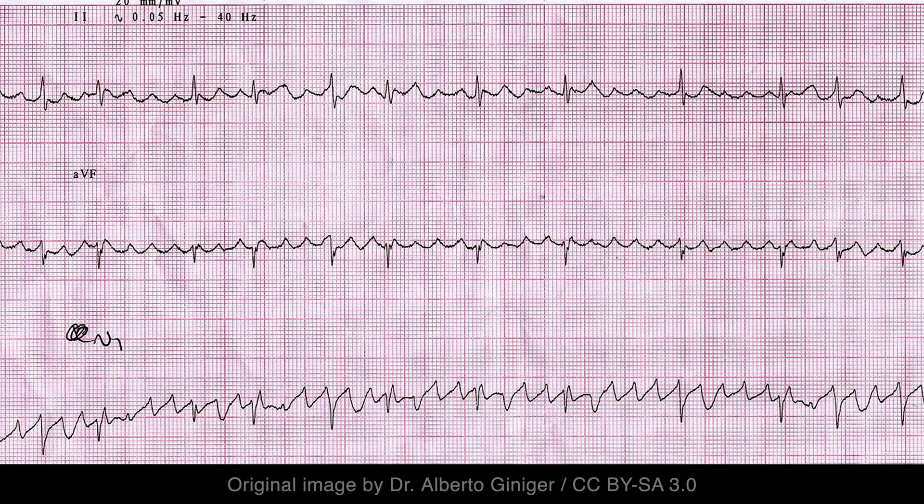Is this atrial flutter? It sure looks like it at first glance, but this is really a case of coarse atrial fibrillation, which can mimic atrial flutter. Note how there isn't any regularity or pattern to the ventricular depolarizations whatsoever.